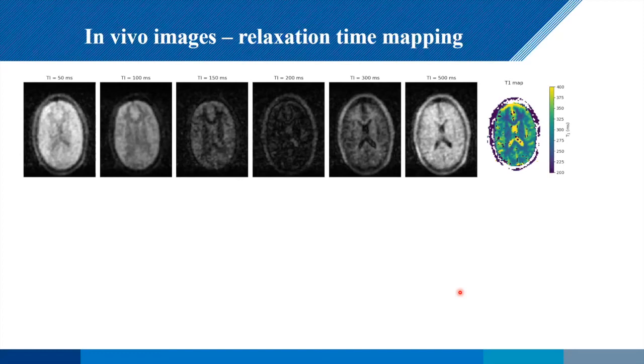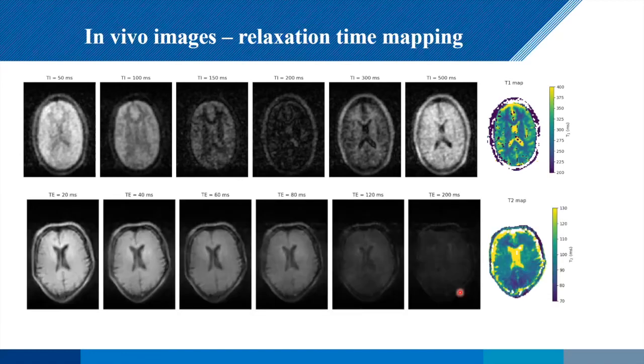So looking at T1 maps here in the brain, and looking at T2 maps, everyone always asks, why do you have a big distortion over here? The answer is that's me. If I put my head down, which I'm not going to, you will see exactly the shape of the head and the brain over there, the pointed part. So there isn't an artifact. At least maybe it's a physical artifact, but it's not an artifact of the imaging system.